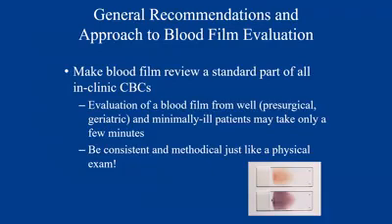And that also goes, this is a cytology group, right? So this also goes for cytologic evaluation. I tend to evaluate my cytology slides the same way every time, with some exceptions, so I don't forget things. I miss things if I don't look at the entire slide, and I focus in too fast on one area. And that same thing can happen with hematology. So just keep that in mind.